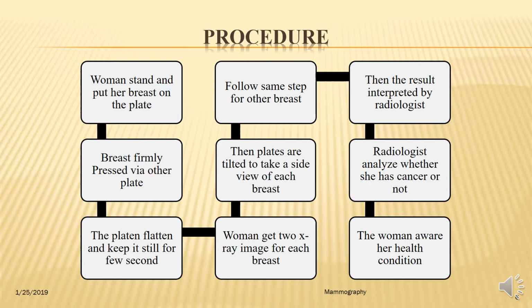This is the procedure of how women are diagnosed by using mammography.